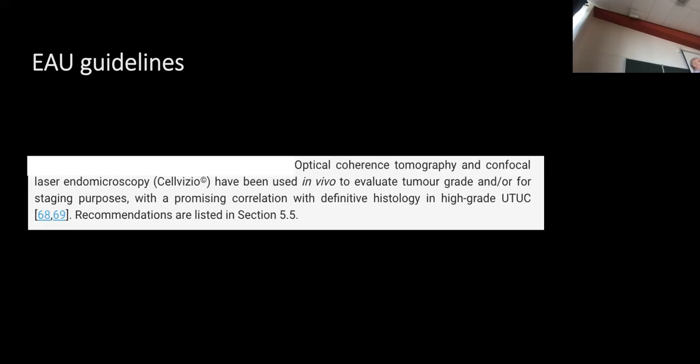OCT is one of the tools that's out there right now, that's in the guidelines as a promising tool to assist with diagnosing this typical urothelial cancer in the upper tract. And that's because of all the work we did back in the day, and we are quite proud of it. And you can imagine that this might actually have a clinical impact. If we are able to do this in a large patient group and show the same results as we showed in our pilot study, we are really in business. And because of this, we now have discussions with the payers about reimbursement of a technology like this, even if it's still in the study.